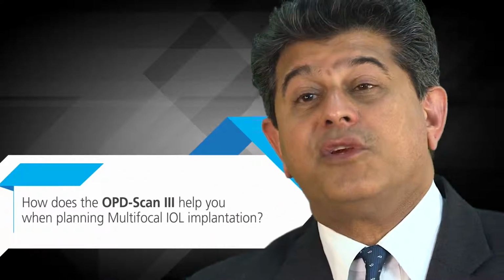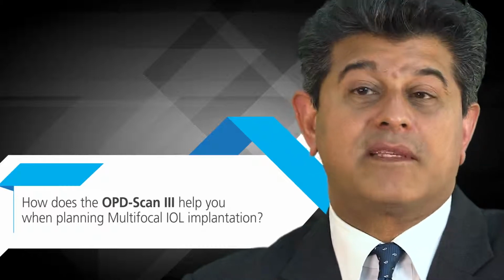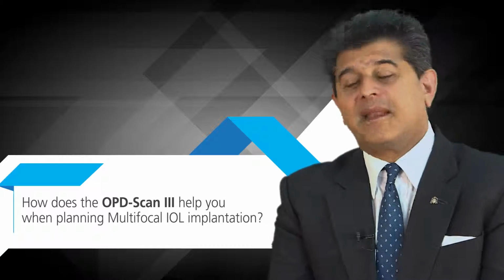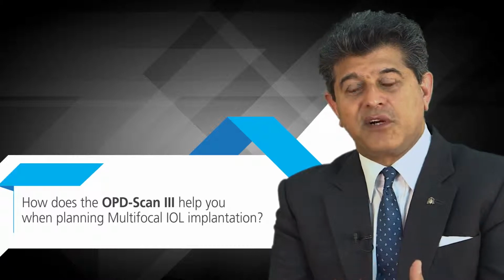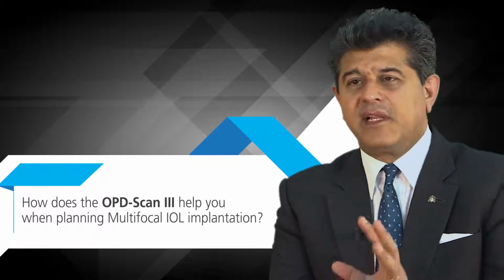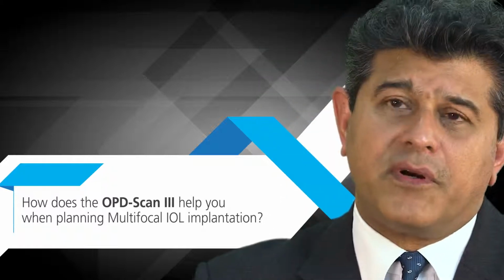A lot of people will say, very dogmatically, you must not use multifocals in post-LASIK eyes. Well, actually, we've been doing it. I started doing this very cautiously, looking at corneal maps, looking at the OPD scan to make sure there are no crazy aberrations in place. The one I'm most worried about is coma, because that is a really visually destructive aberration.